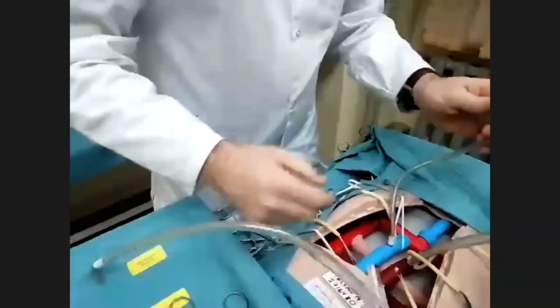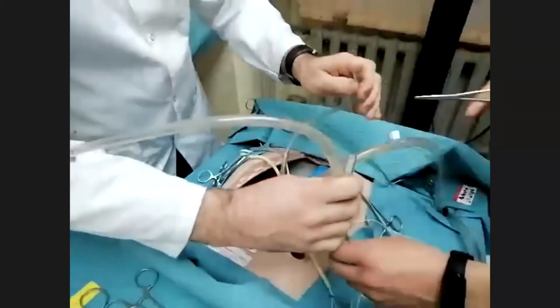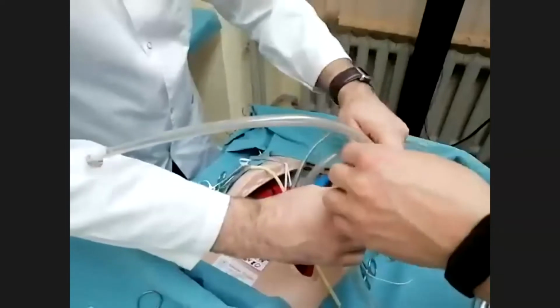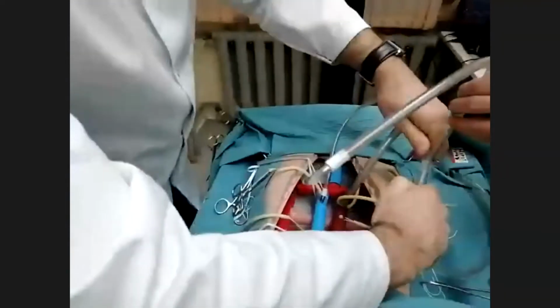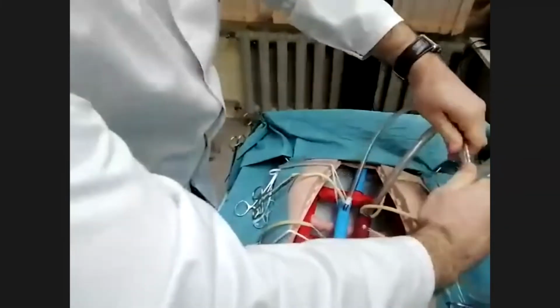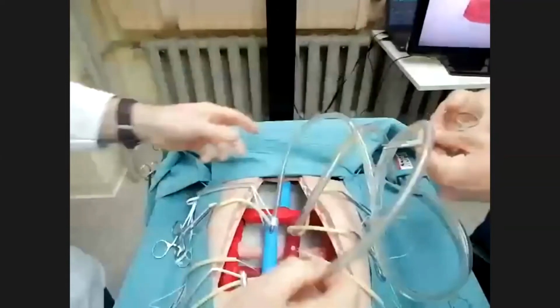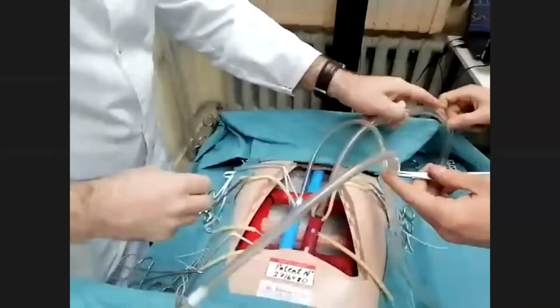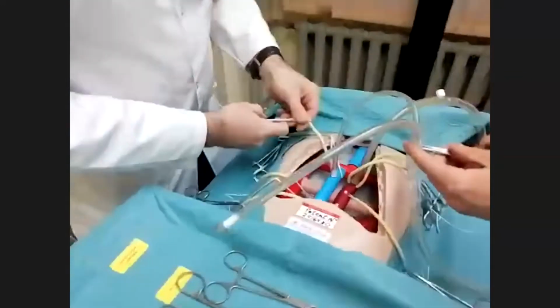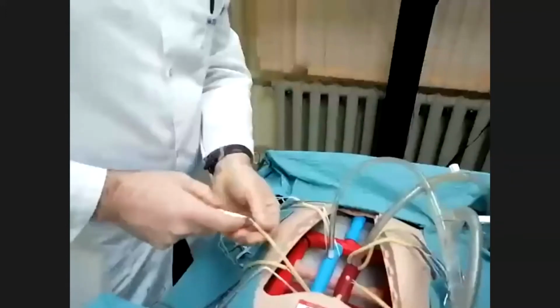Next. Connection to the Y-shaped connector, and then we are on bypass. Okay, on bypass. Cooling to 32 degrees. Okay.